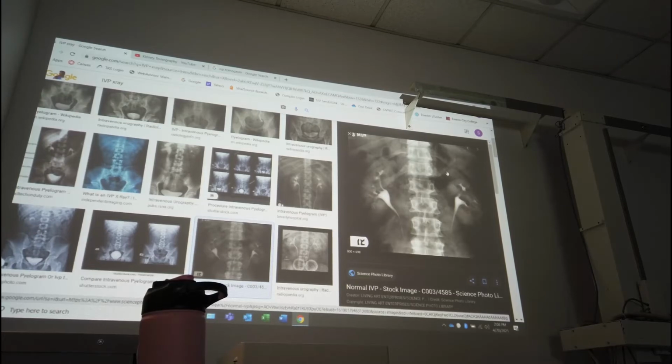But anyway, so the bladder, the ureters and stuff like that, we don't see them. So the only way we can really visualize this stuff on radiographs is to introduce contrast. And there's two ways we can get contrast into the urinary system. One is to pump it through the urethra. We call that retrograde, so a retrograde exam.